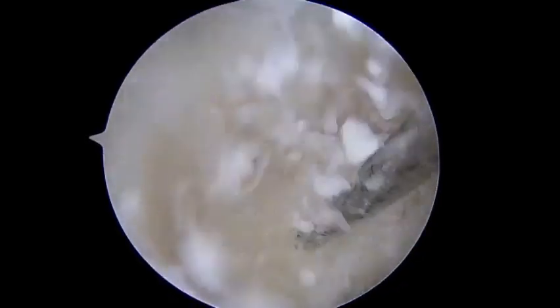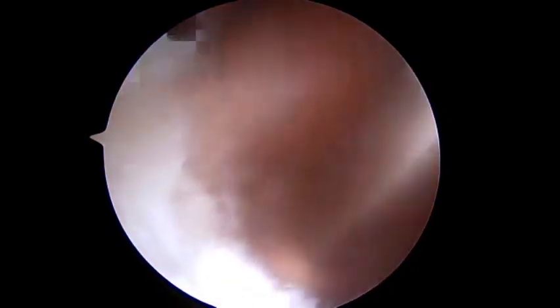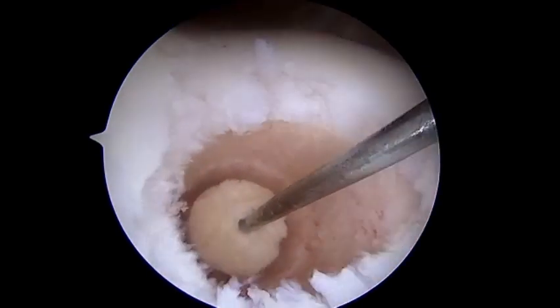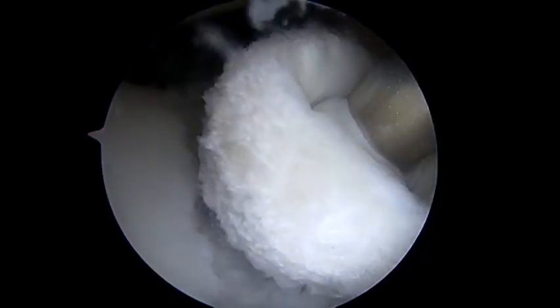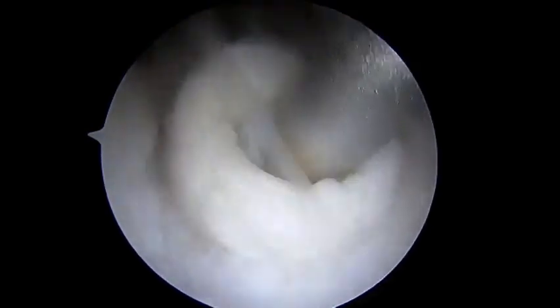It's a bone preserving, subchondral bone preserving type technique, and allows the healthy marrow access to come up through the implant, which is a hollow type chambered implant. Here we can see the nice marrow contents. This is the graft implant construct coming down with the driver. This is over a guide wire as well, so it's guided.